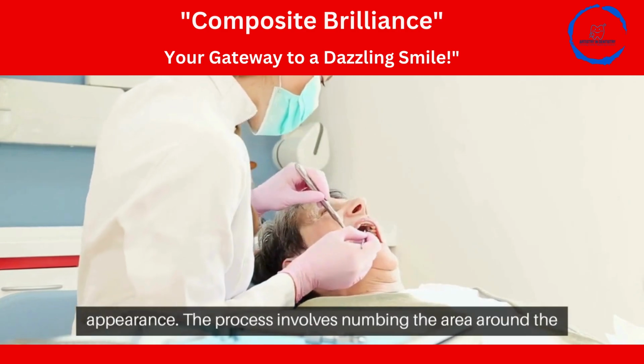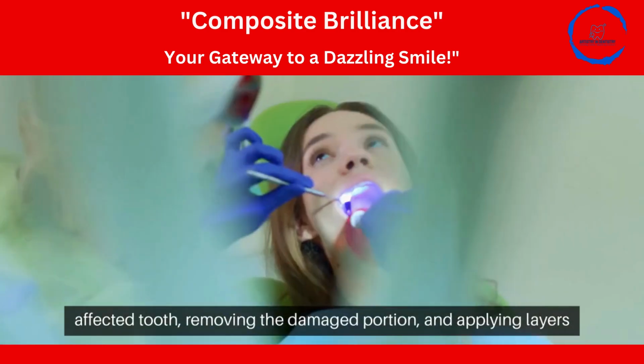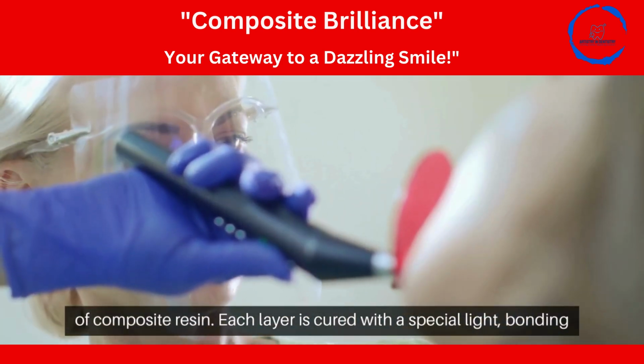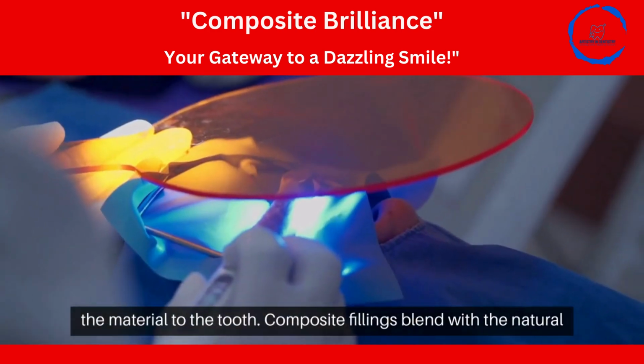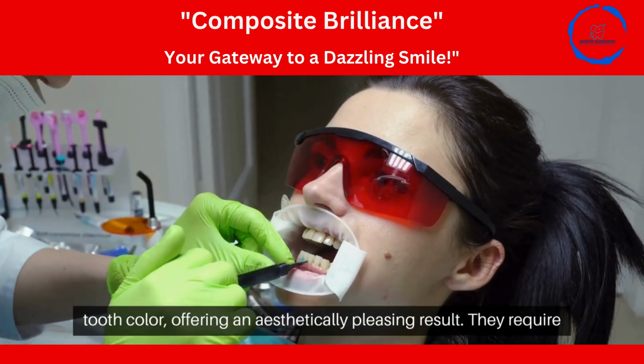The process involves numbing the area around the affected tooth, removing the damaged portion, and applying layers of composite resin. Each layer is cured with a special light, bonding the material to the tooth. Composite fillings blend with the natural tooth color, offering an aesthetically pleasing result.